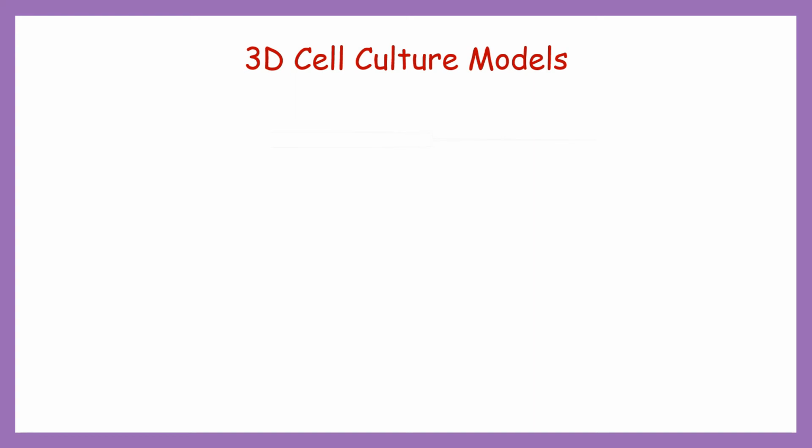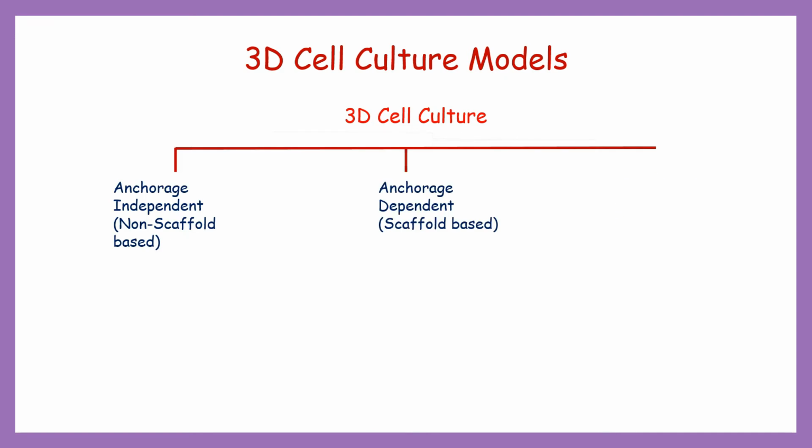Now let's talk about the 3D cell culture models. They have been divided into three categories. First is anchorage independent, that is also called non-scaffold based. Second is anchorage dependent, also called scaffold based. And third is specialized 3D culture platforms.